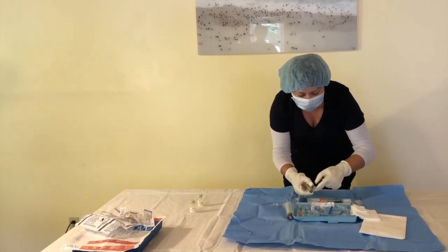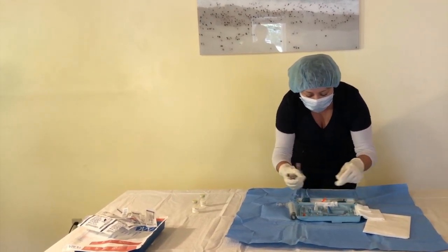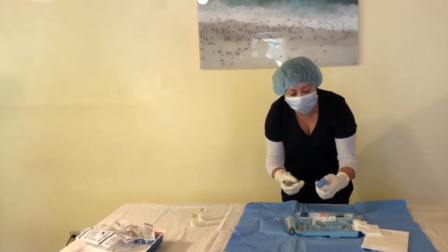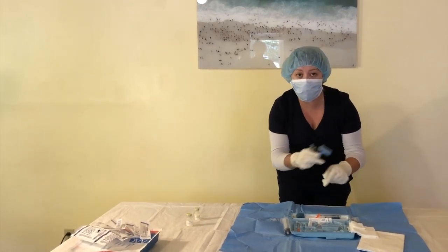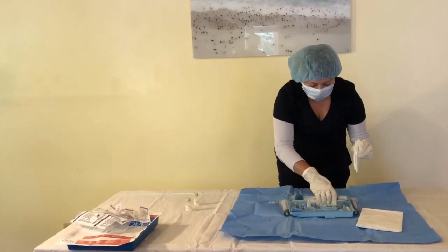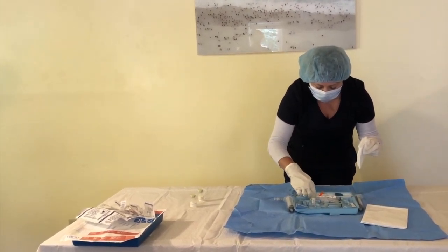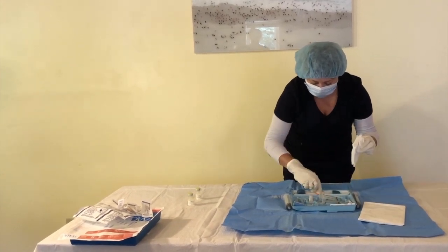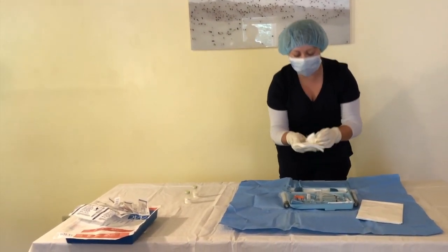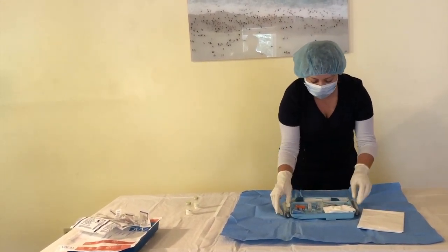And you have little syringes. Just make it pretty because you never know what's going to happen and they need to be able to see what they have if they need it. And here's some more sharps as well. So I'm going to put these all together. If you have a razor, sometimes if you need to shave where you're going to be doing it because you need to clean everything, put that there. Make sure all the little syringes are together. And we have some gauze and little napkins because it can get a little messy after. So now we'll place these back on top.